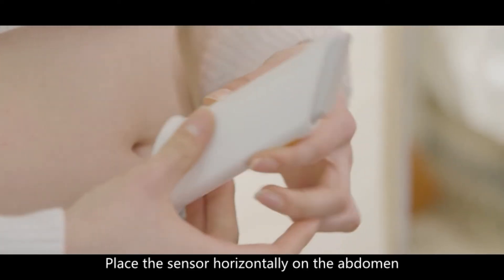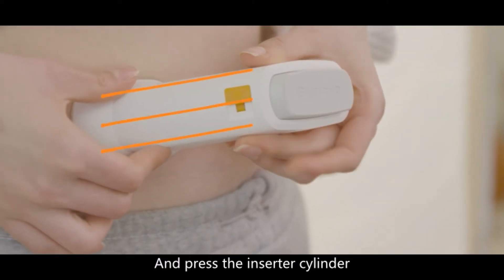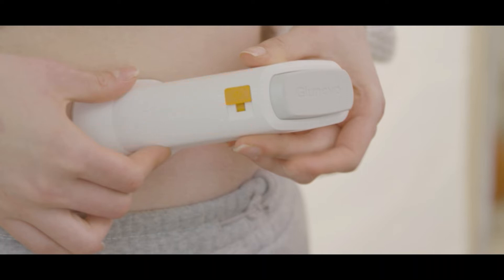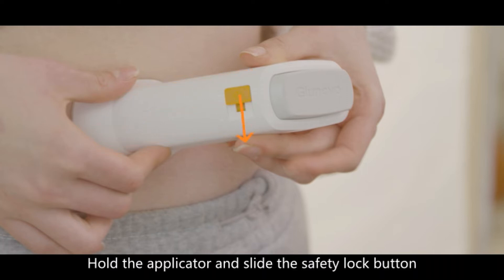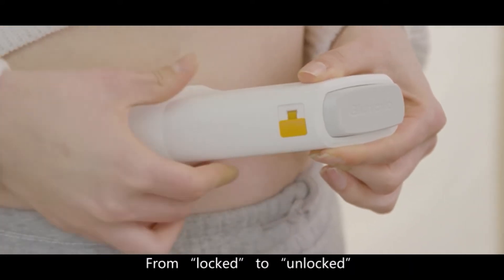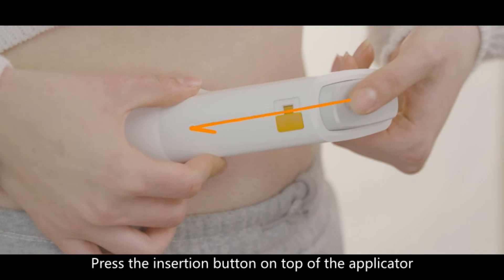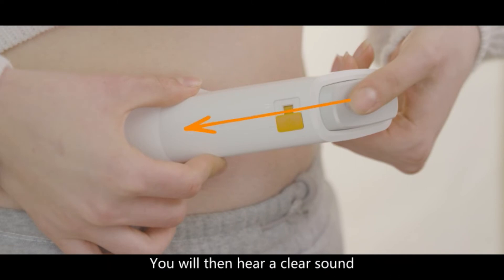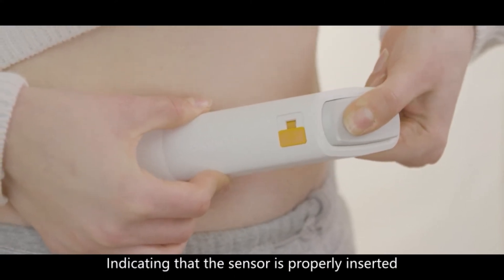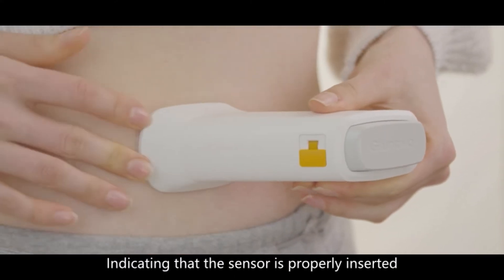Place the sensor horizontally on the abdomen and press the inserted cylinder to ensure that the tape is firmly attached. Hold the applicator and slide the safety lock button from locked to unlocked. Press the insertion button on top of the applicator. You will hear a clear sound when the application spring is triggered, indicating that the sensor is properly inserted.